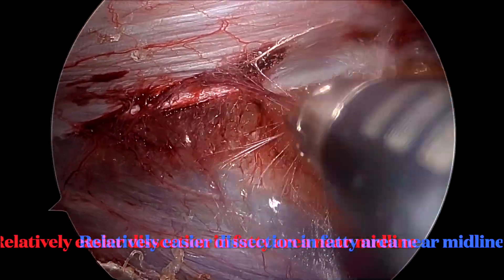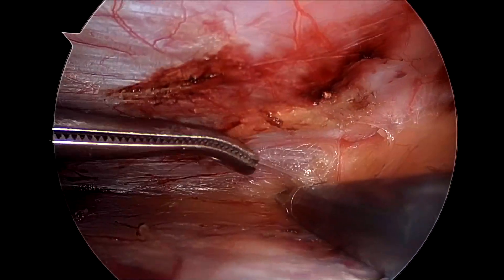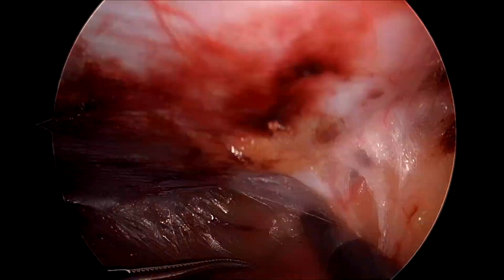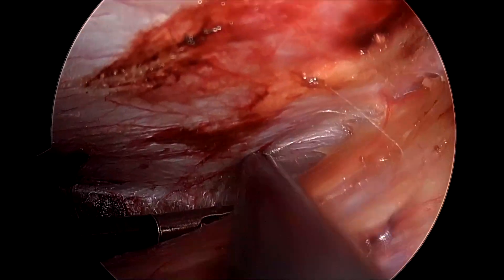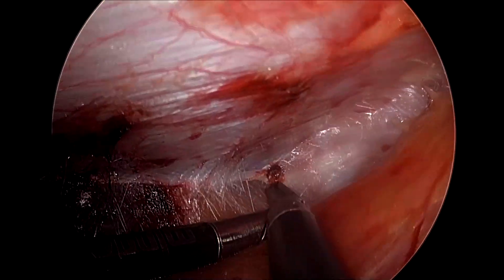As we approach the fatty area towards the midline, the plane becomes much better and the dissection becomes much easier. The idea here is to remain close and flush to the posterior rectus sheath and linea alba rather than being towards the peritoneum surface.